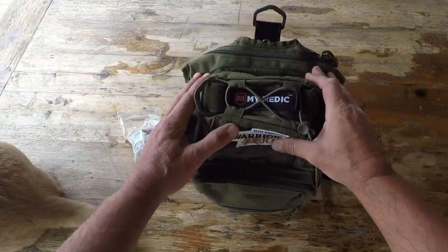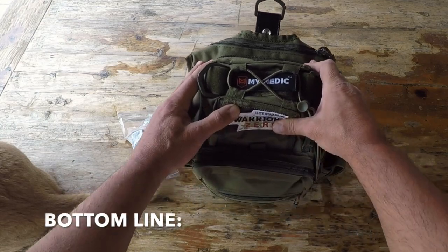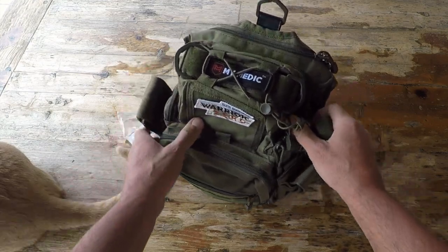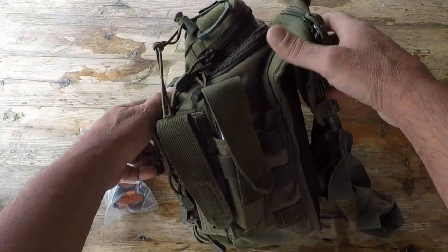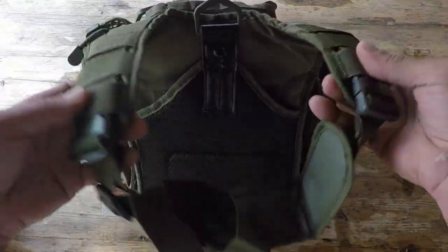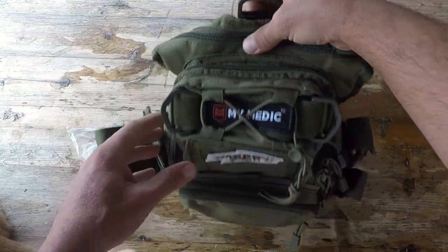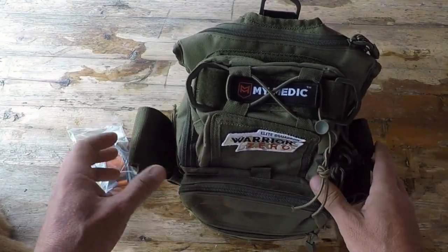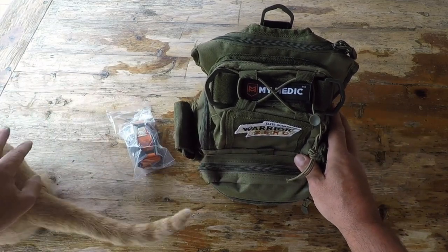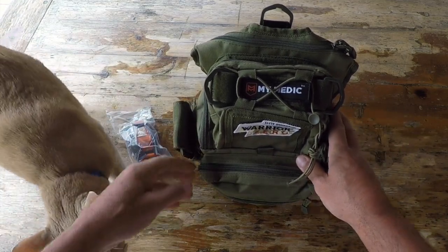So bottom line, if you're in the market for a quality, durable first aid kit that comes with a lifetime warranty, contained in a pack that you'd be hard-rivaled to find something to match in quality — take a look at these kits by My Medic. I'm a fan of them, my family is a fan of them, my cat is a fan of them. And I'm sure if you pick one up, you'll be a fan too. Once again, this is Helder — I hope that you found this review helpful.